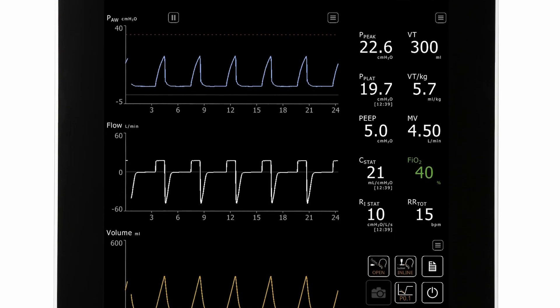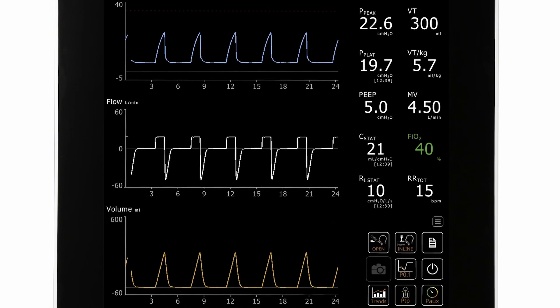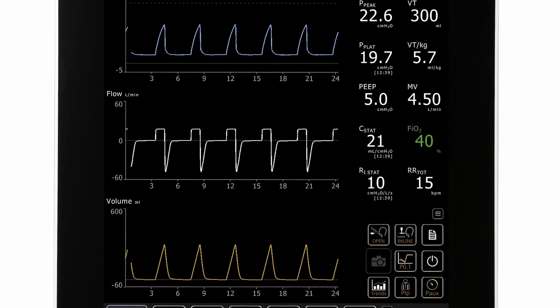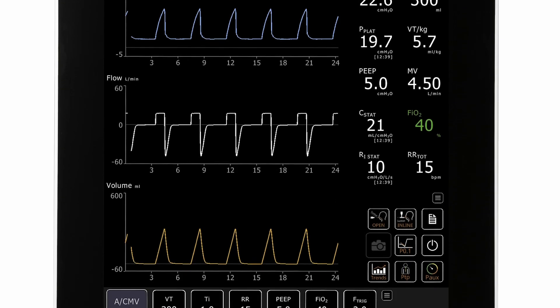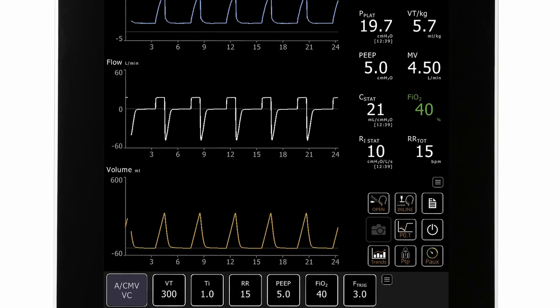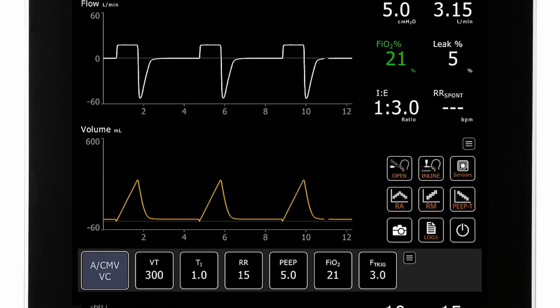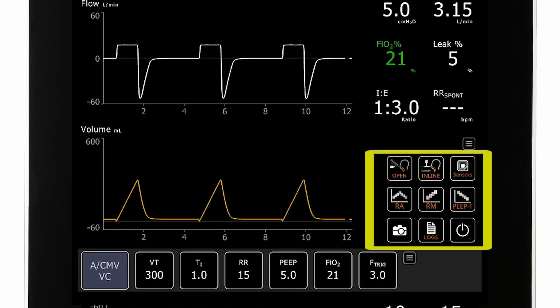Next is the waveforms area. Clinicians can select which waveforms or loops to display and also the scaling. In the numerics area, clinicians can configure how many monitored parameters are displayed and which parameters are displayed.